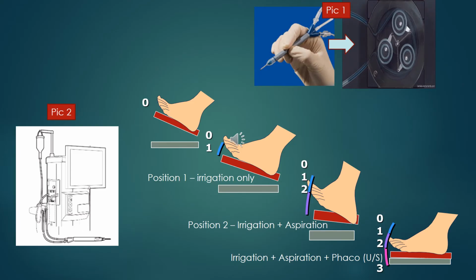As you can see in this video, the pump is rotating, and as it rotates, the hub roller rotates. In this picture you can see three pinch rollers. So these three pinch rollers are also now rotating. As it rotates, it will pinch the tubing that goes over it. It pinches, squeezes, and releases.